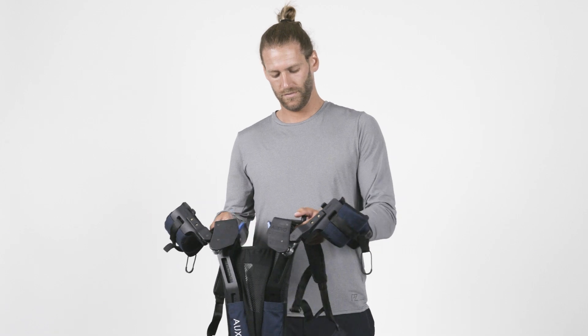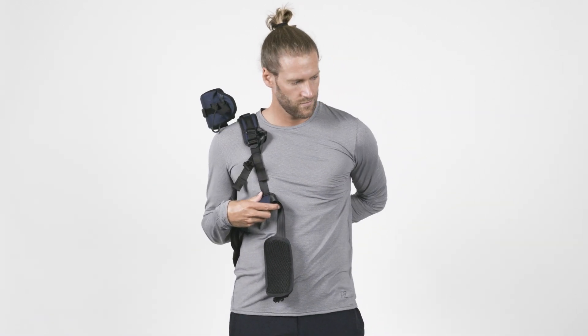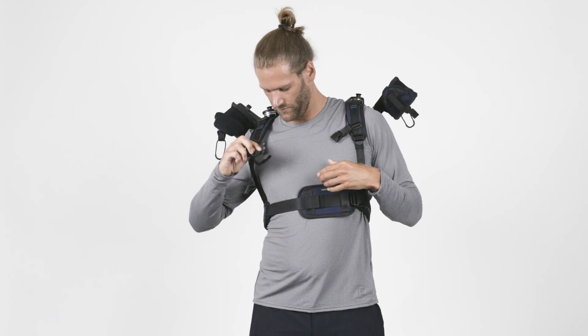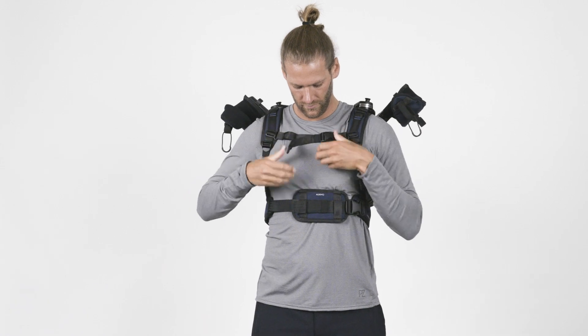Once you are familiar with the features of the DeltaSuit, you can start donning it like a backpack. Once you wear it, close the two buckles in front of your chest and tighten both chest straps slightly.